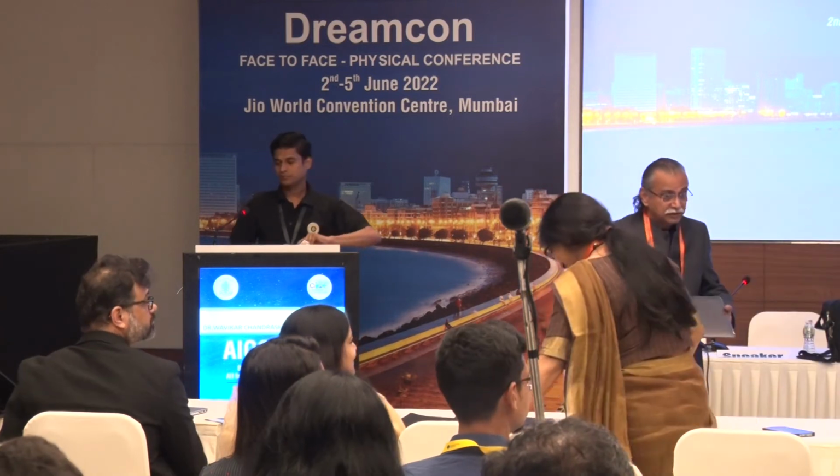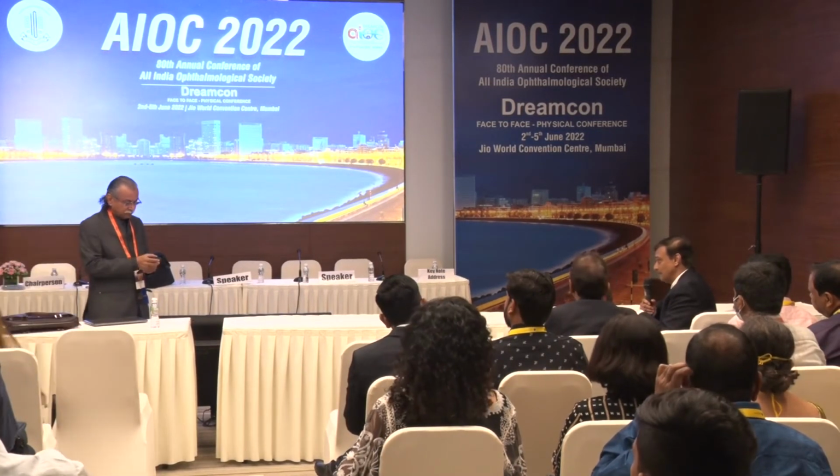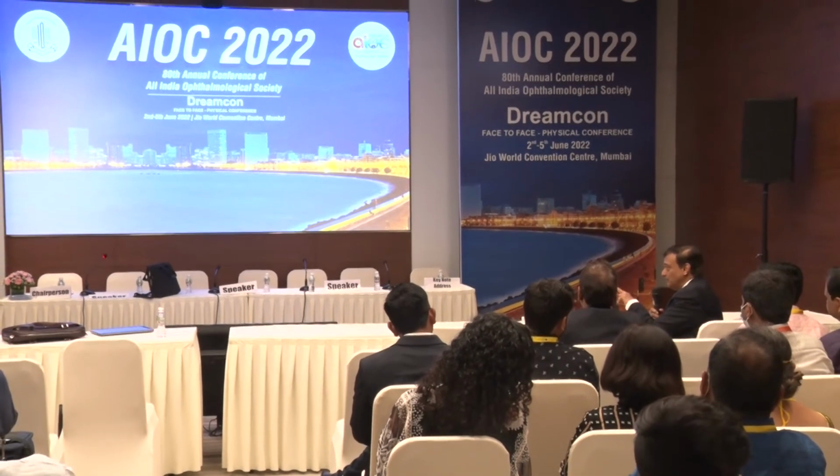Can I add one point regarding hydrodissection and delineation? Dr. Vasavada has mentioned inside out hydrodelineation. So you don't do any hydrodissection, but you start phaco, debulk the center. By doing that, you are actually doing inside out hydrodelineation. And another point is that you can do separation mechanically by using a Sinskey hook instead of injecting fluid. These 2 points I just wanted to add.